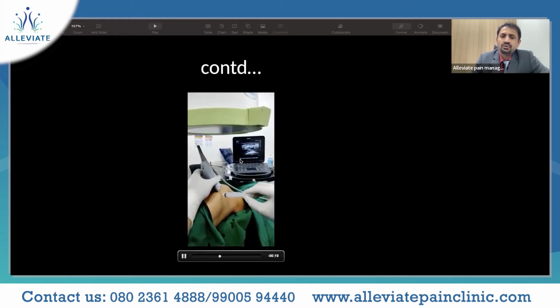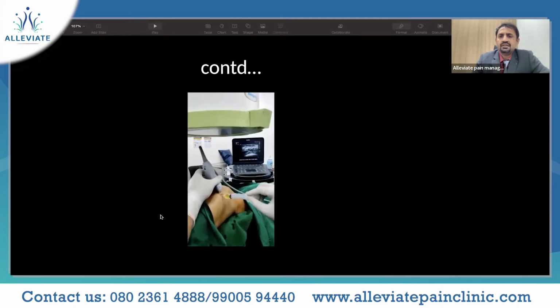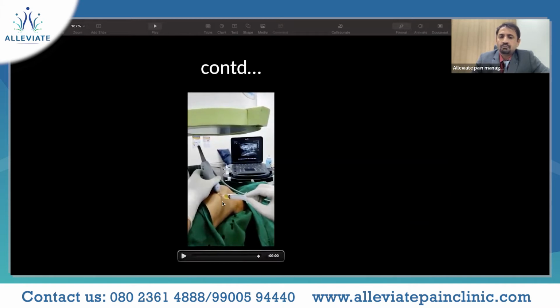Also, the fluid which you're going to tap out is going to give you an insight about what could be the pathology. That's very important. In this case, it could be inflammatory or non-inflammatory fluid, but whatever you tap out, it is ideal to send it for analysis. If the fluid color is reddish or a blood tap, it's ideally an intra-articular bleed which has happened.